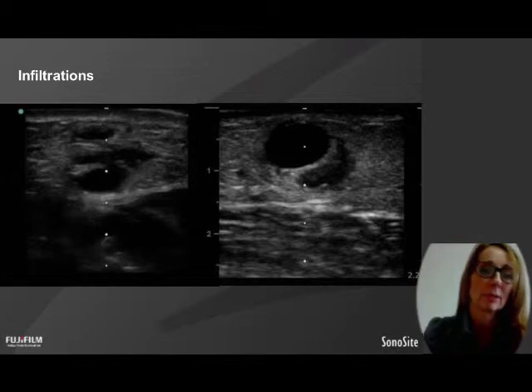So the first one on the left, there was a whole lot of hematoma sitting over the vessel. The staff were palpating to cannulate and feeling the hematoma and thinking that the vessel was actually quite shallow, but it wasn't vessel, it was hematoma. And they were trying to repuncture in that area and not getting any flashback, so started to change the position and cause more trauma and hematoma because they didn't realise that the vessel was actually too deep through the hematoma to puncture.